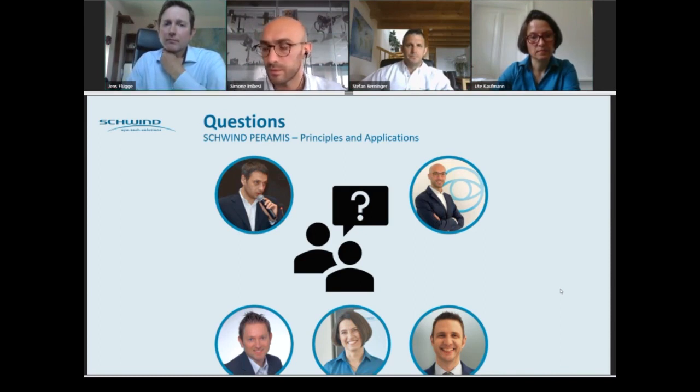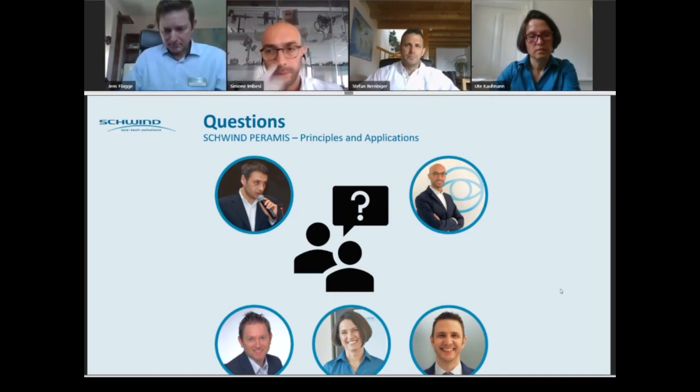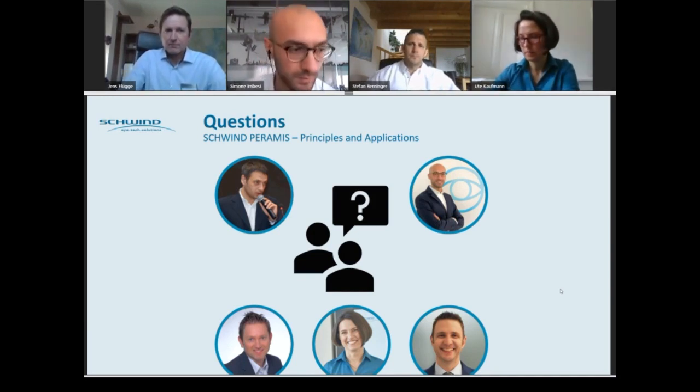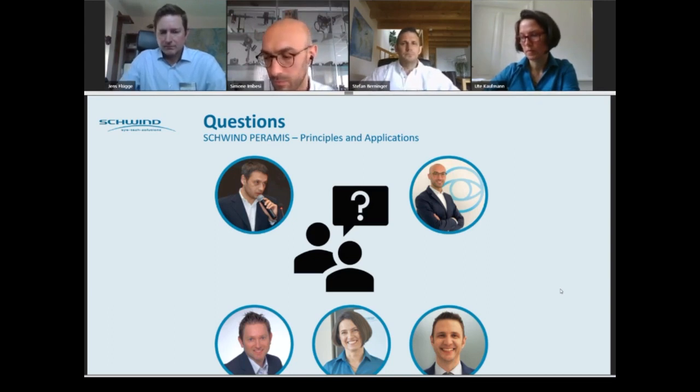Probably this question has the same answer as the one that I answered before. If we can define some good metrics to evaluate the quality of a wavefront, and such a metric is the Strehl ratio, so the quality of the peak of a PSF, we can try to remove the high order aberration components and see what is the optical best solution that minimizes the size of the PSF or maximizes the Strehl ratio.